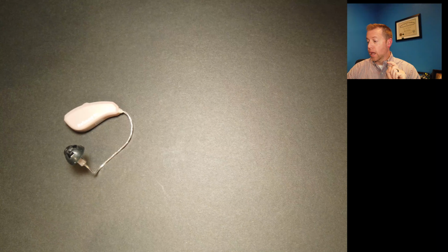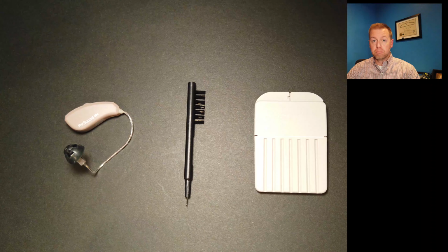Oh yeah, okay. It makes sense to show you rather than just tell you. So, we're going to need a hearing aid, brush, and wax guards. Perfect.